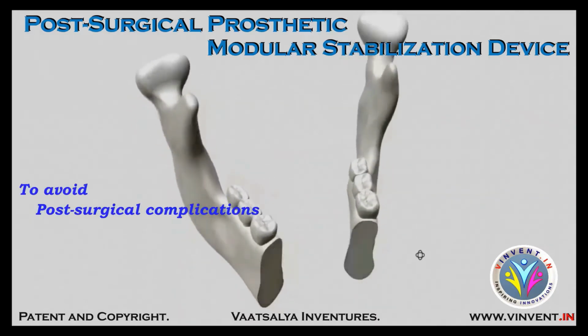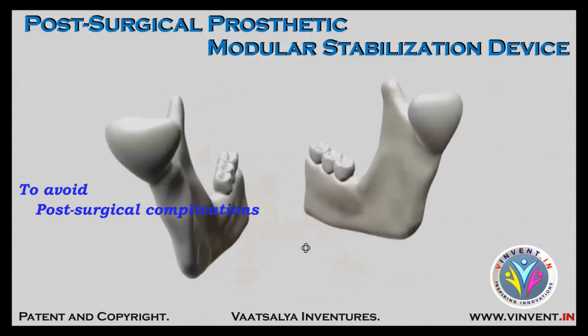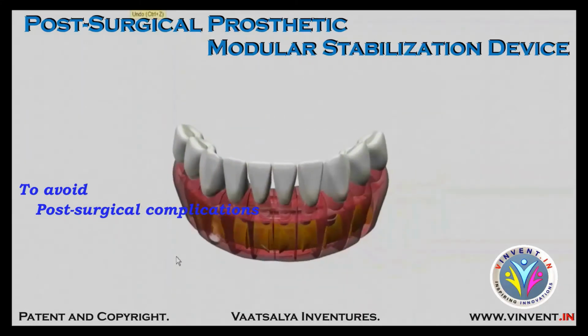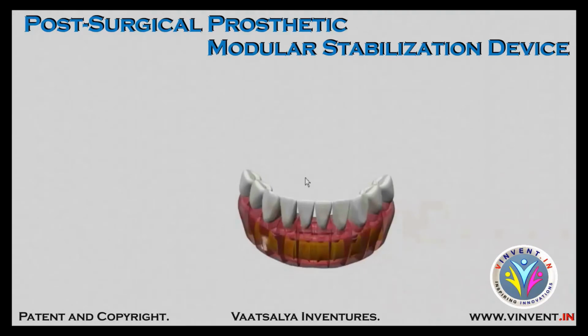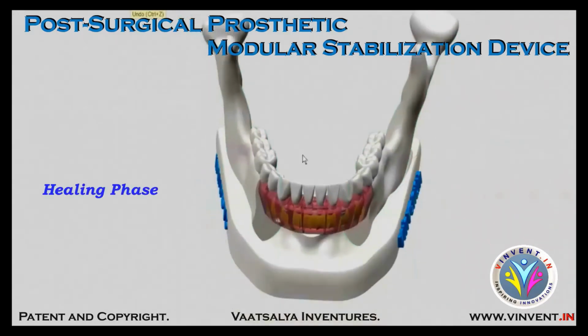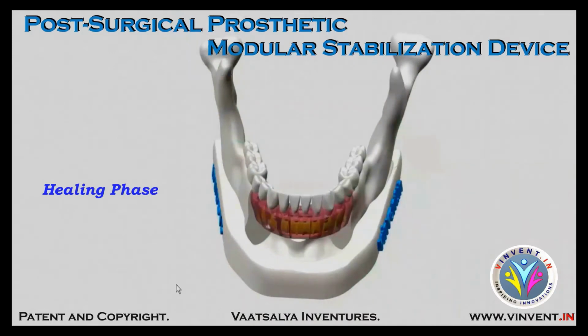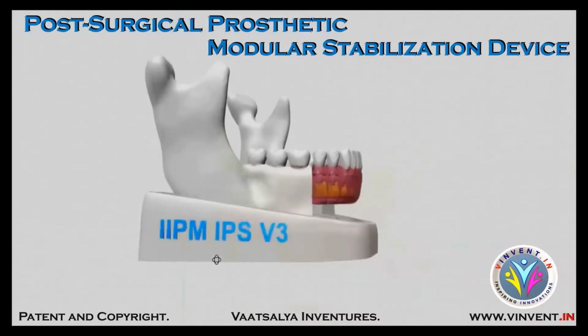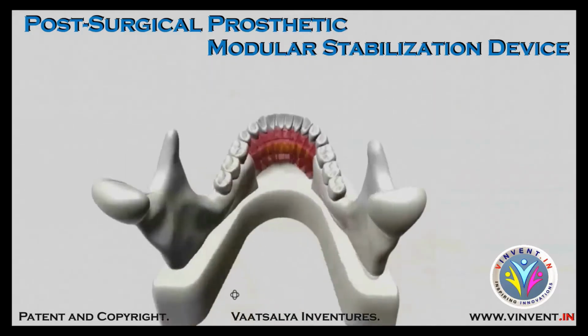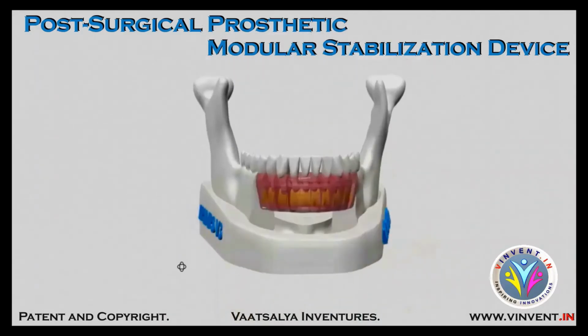In order to avoid the post-surgical complications of surgical excision of anterior mandible, we have made this particular device to be able to restore the section of mandible during healing phase and maintain hard tissue, soft tissue and occlusal relations until a definitive prosthesis can be made.